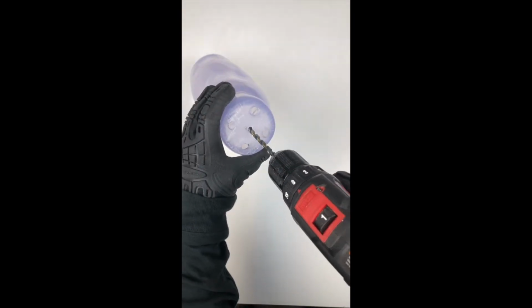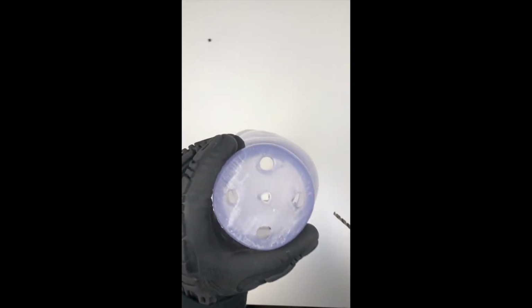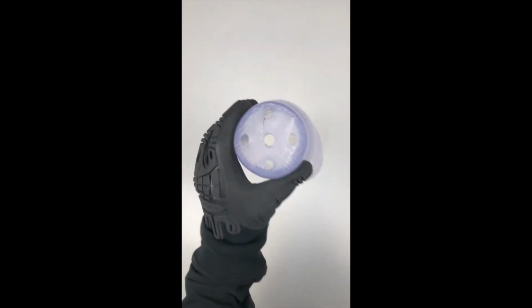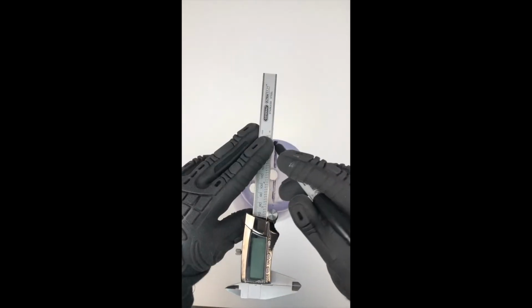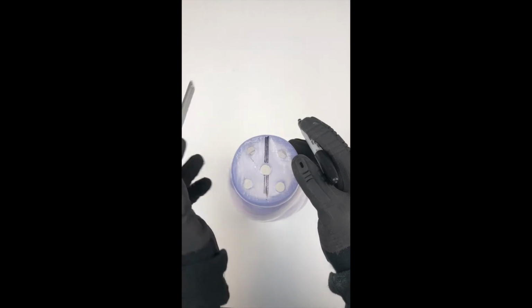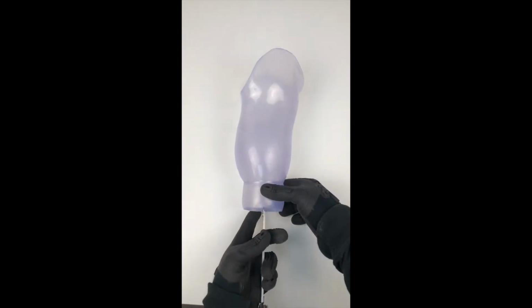Drill out the center hole of your socket with a 1/4 inch drill bit. Use a 1/4 inch to 1/2 step bit to widen the center hole. Bisect the distal aspect of the socket in the orientation you would like to place the charge port. Extend the line upward on the side of the socket wall.